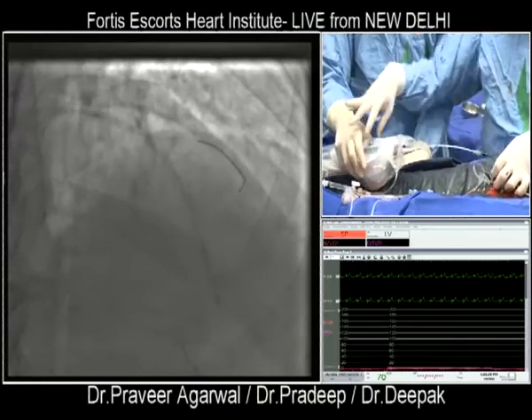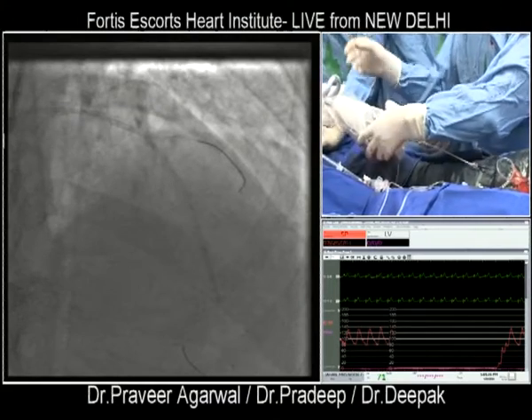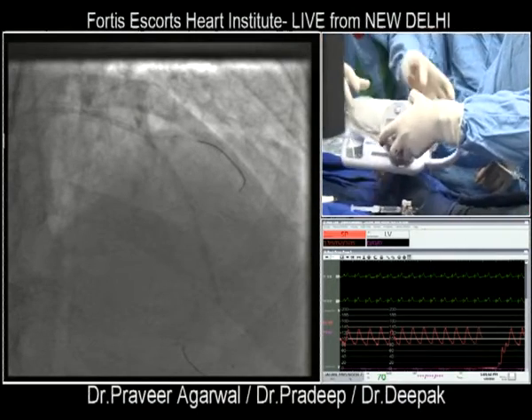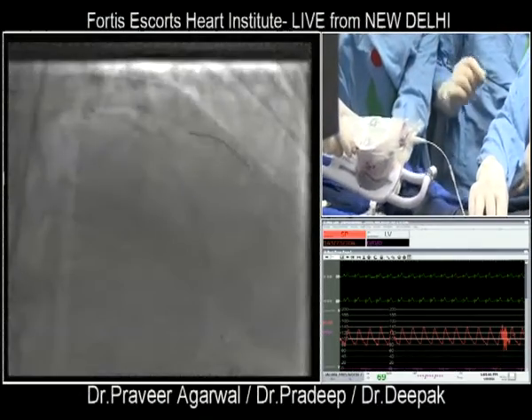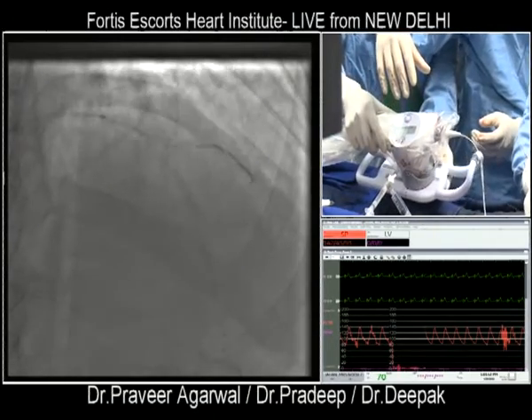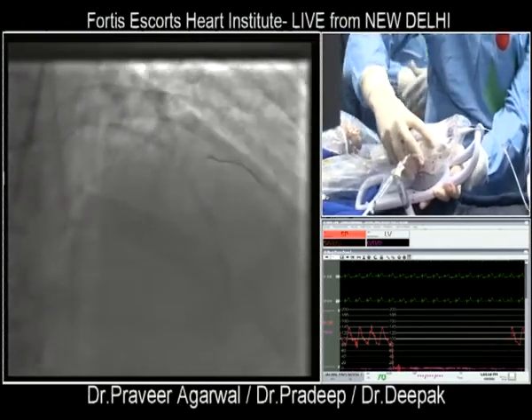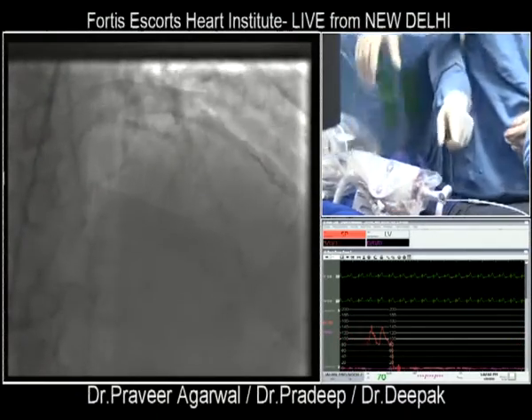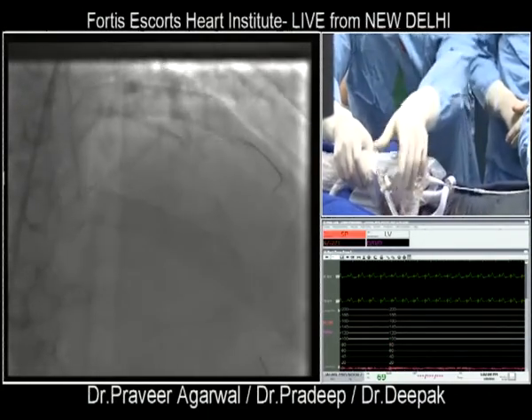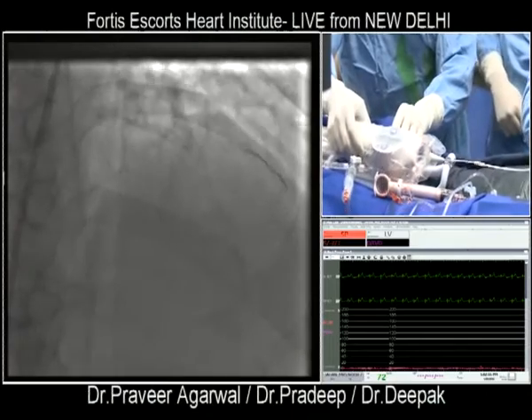So now I've gone beyond the first stent. What did it do? Don't do that. Everything is out. Just relax. Just leave it. Let me do the manual pullbacks. Just hold. So it's done. I only see that they don't need any imaging for stent pathology. So that's maybe after stent. No, there's some problem there. There's some problem there.